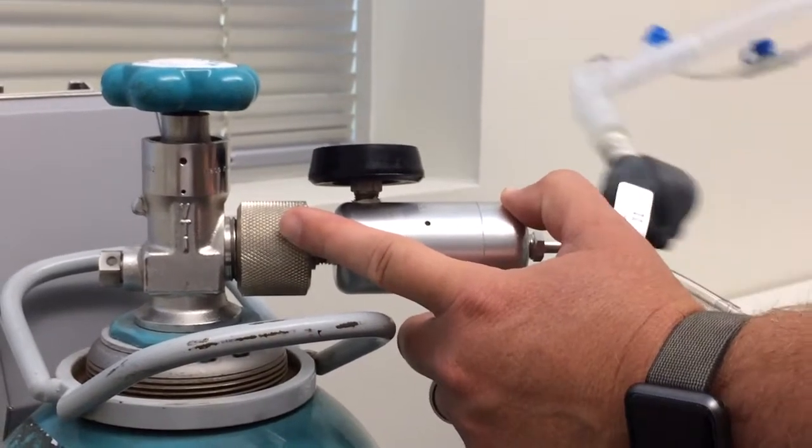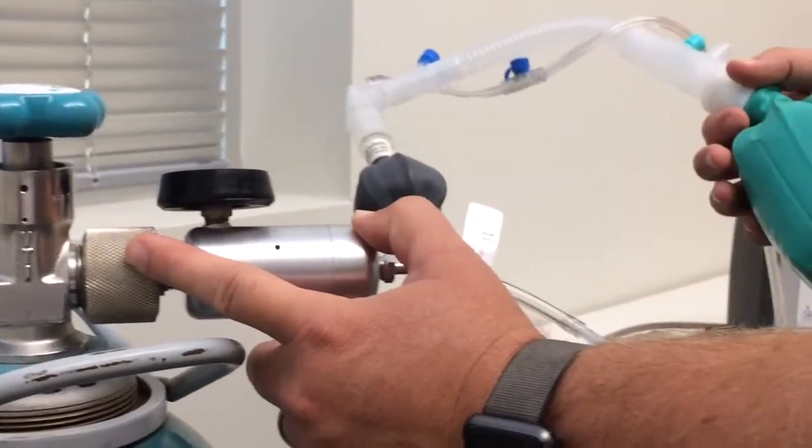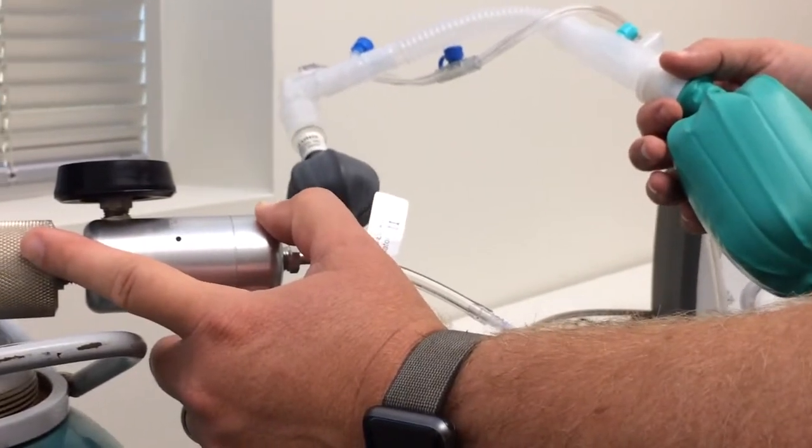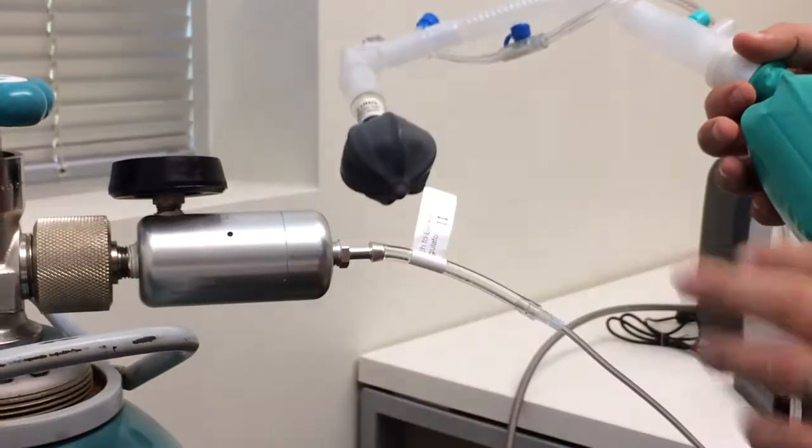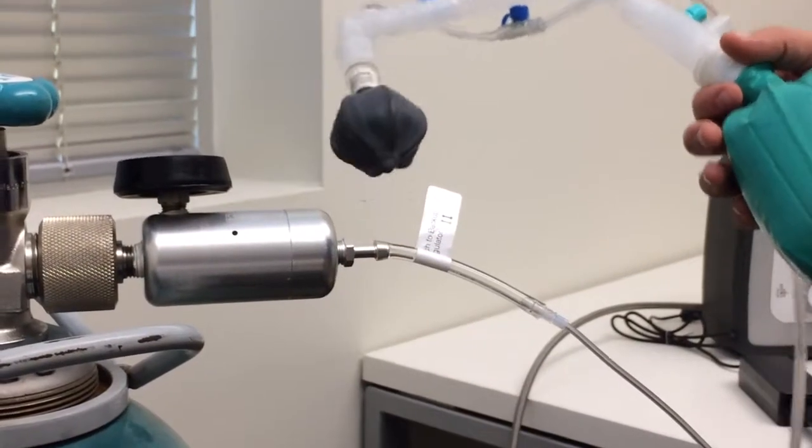Therefore, when you run 10 liters per minute of oxygen through the system, you're given 20 parts per million having that hooked directly to the tank, and you don't have to have the Aranox with you to do this.